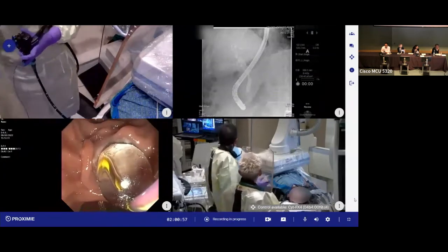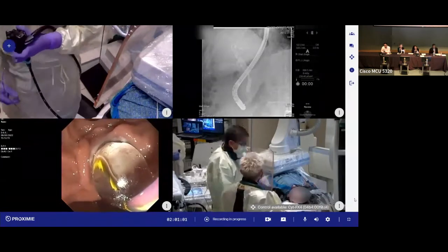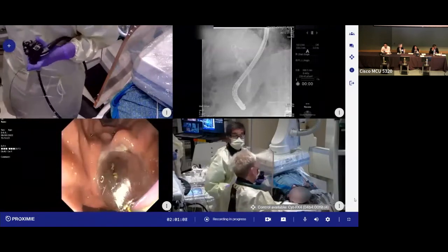So Jeff, do you agree we should stop at 11? Wouldn't go more than that. Would not go more than 11? Yeah, I agree. Is the panel okay with that too? Yep, I think that's good. Okay, so we'll do this, and then we're going to use that 9 to 12 extraction balloon.